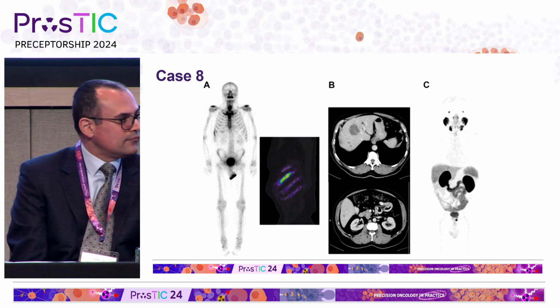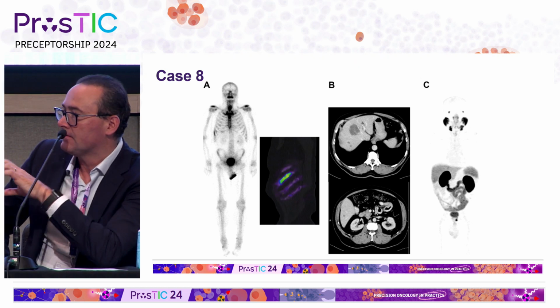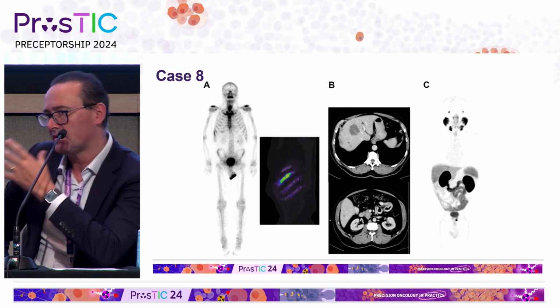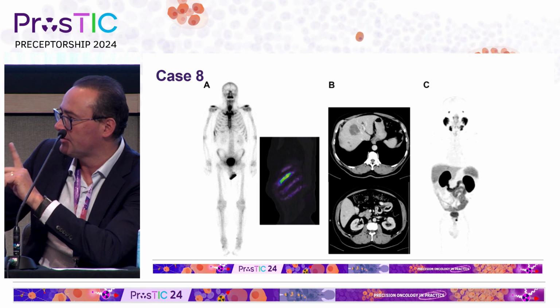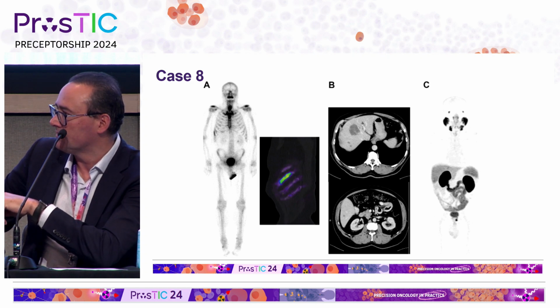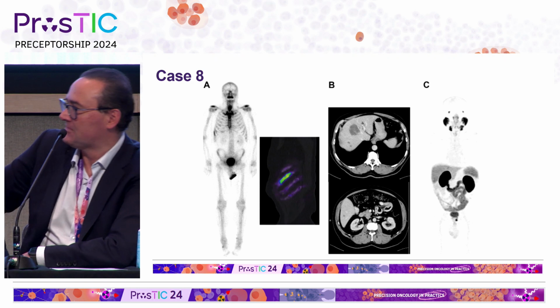I had a case recently where a patient had a 4+3 cancer, PSA 13, only in his 50s, and the PSMA PET showed a completely non-avid prostate, but a very avid retroperitoneal lymph node, which was a bit weird. So I got an FDG PET, thinking it was one of these mixed clones. The FDG PET showed negative prostate, positive lymph node. It's not adding up. So I didn't believe it, I biopsied it, and sure enough, it was prostate cancer.